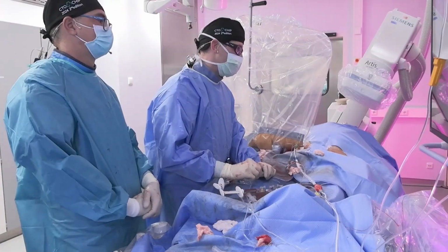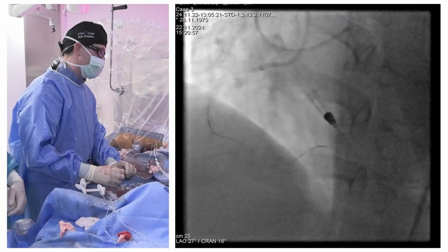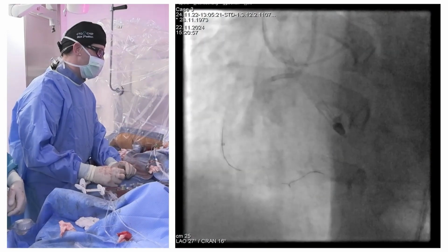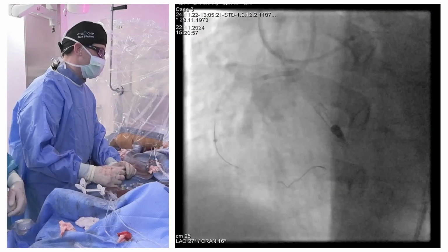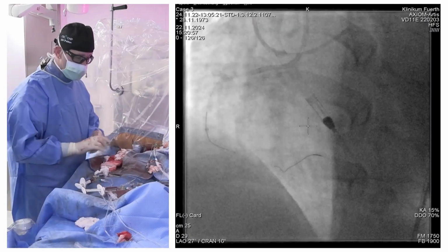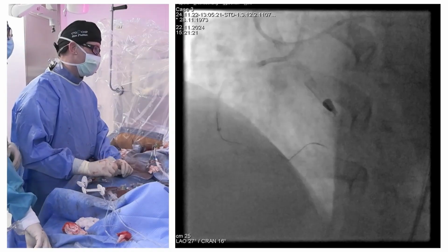Right now, I have been further with the wire than this here. I basically had the problem that the Gladius was forming a knuckle and I was not able to advance the knuckle into the guide extension, and now I switched, and then I wanted to switch back to a new one, and of course then we are there that it's not moving that much anymore.